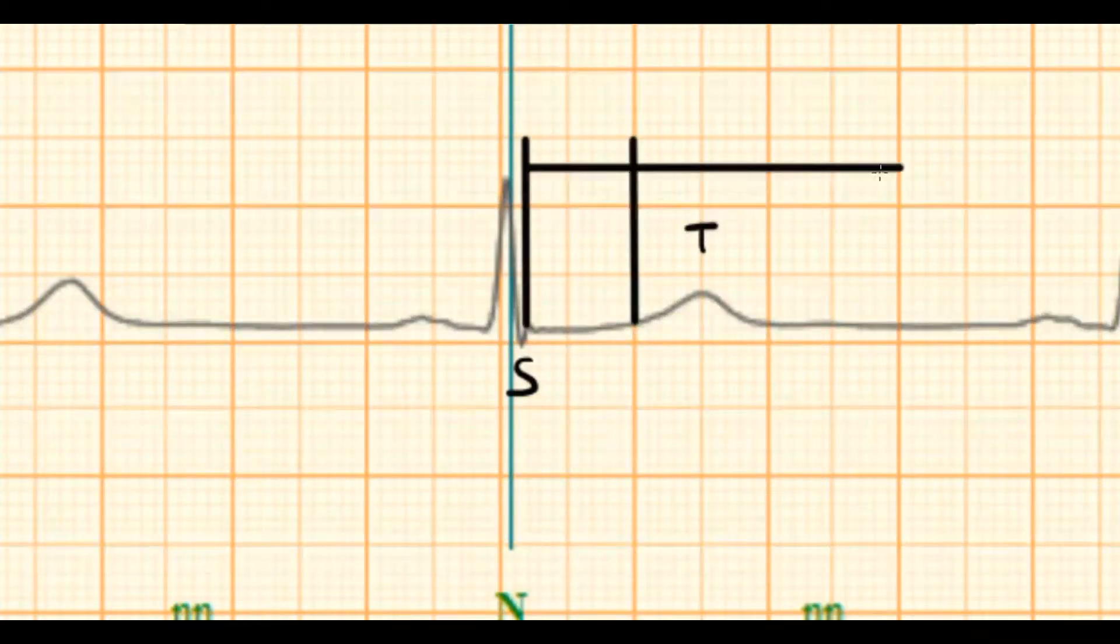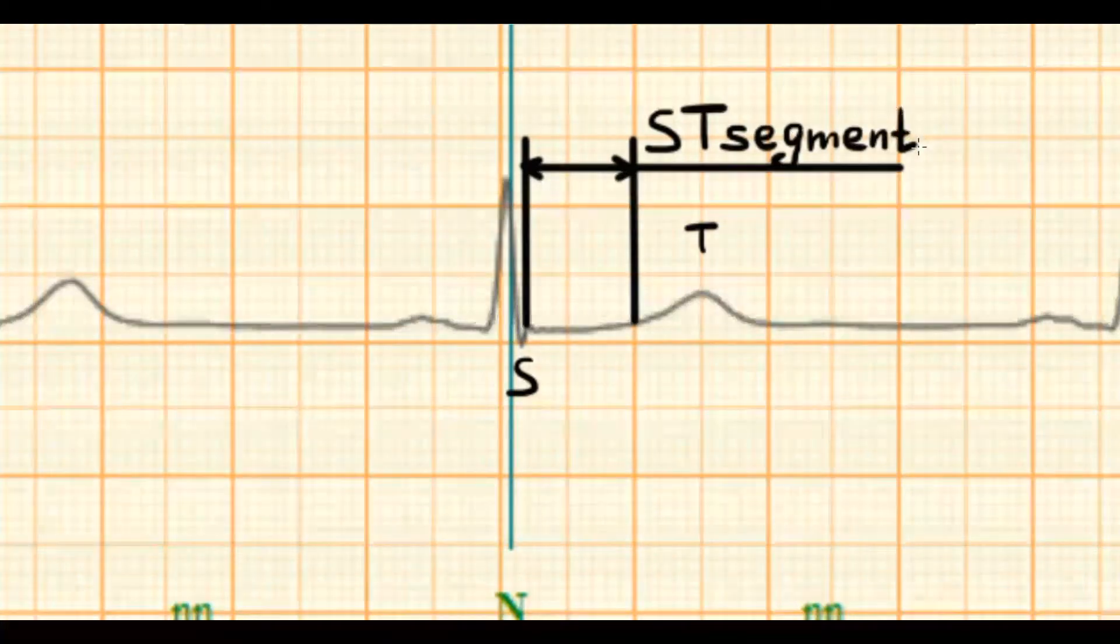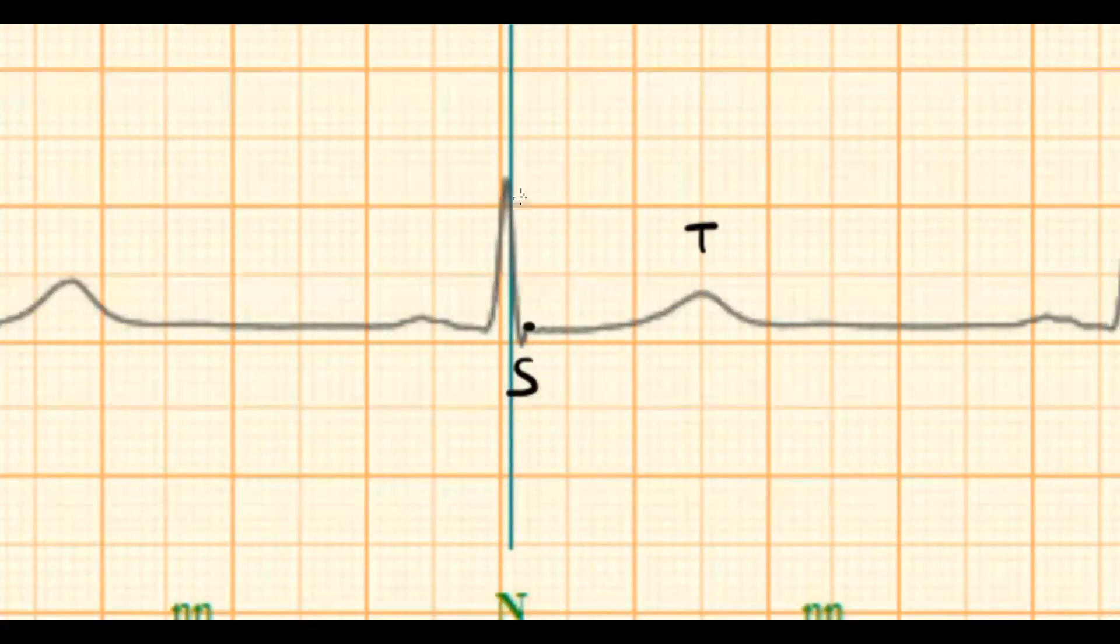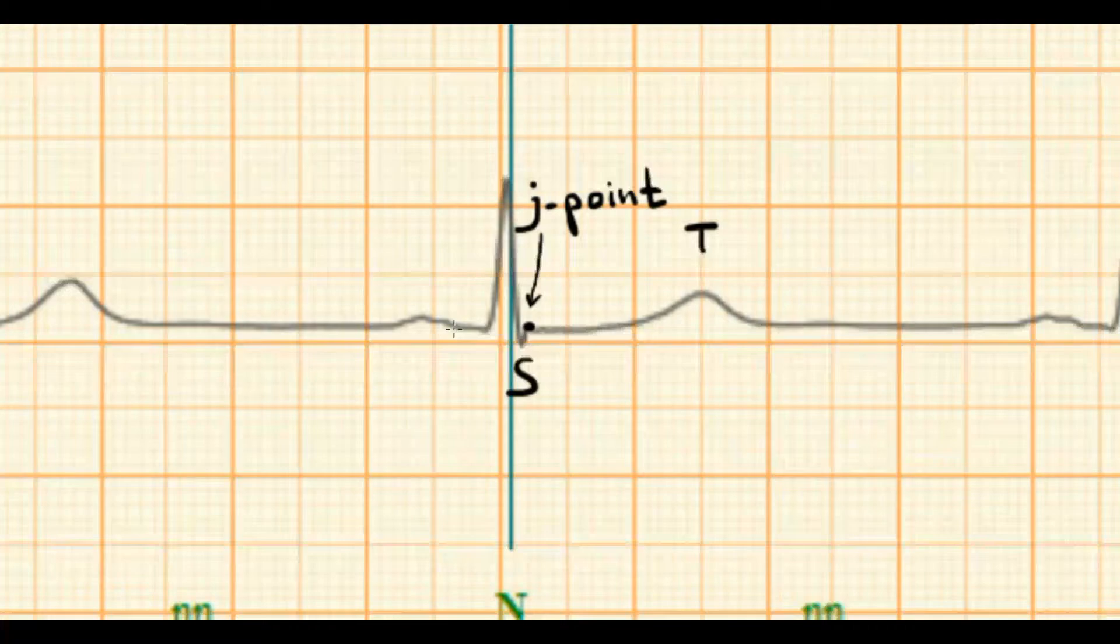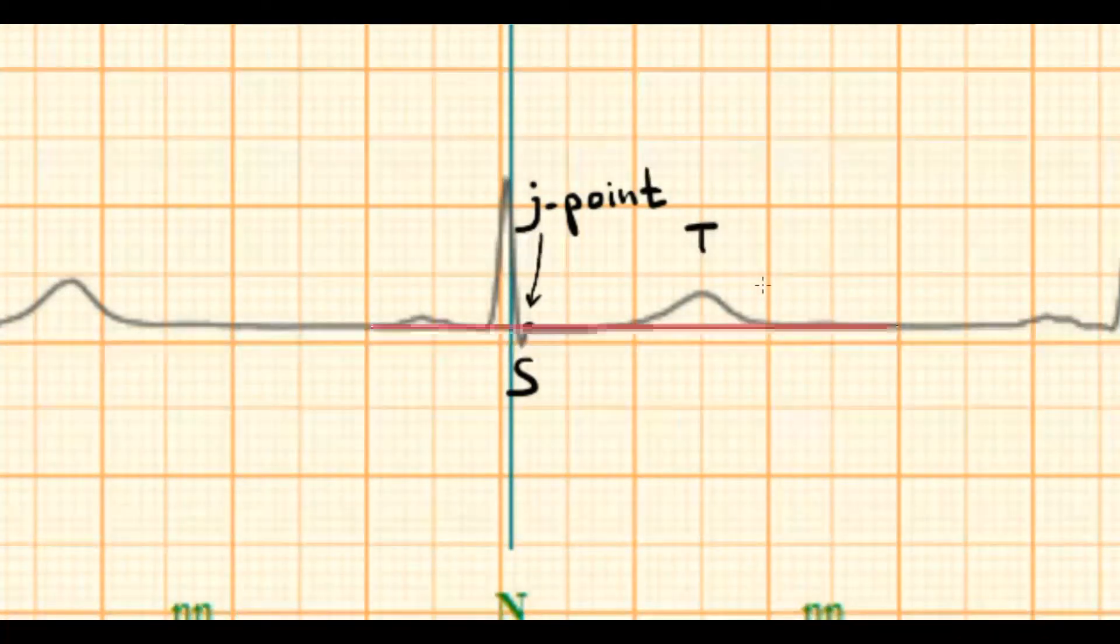This is ST segment. The point where QRS complex goes to the ST segment called J point. The J point is the key for understanding the changes of ST segment. As a baseline we use TP or PQ segment.